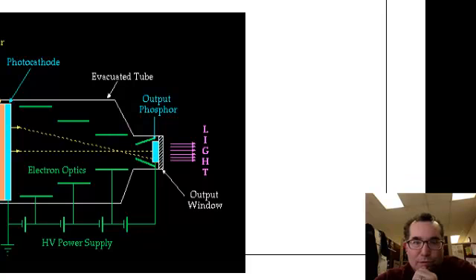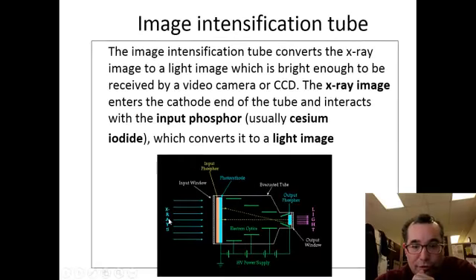Okay. So this is what I meant by your image intensifier unit kind of looking like a cylinder, almost like a big milk bottle. And you can see there is a chain of events. Right? We're going to start with X-rays, and we're going to end up with light. And to take it a step further, our video tube is going to be out here somewhere.